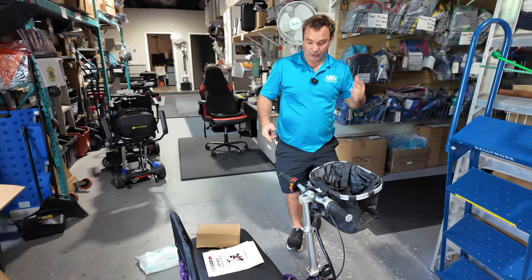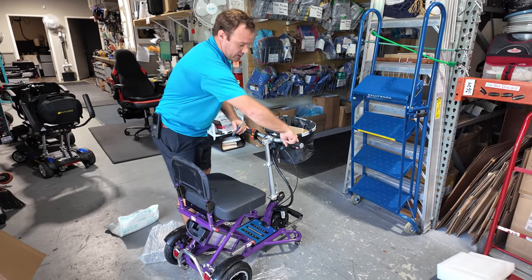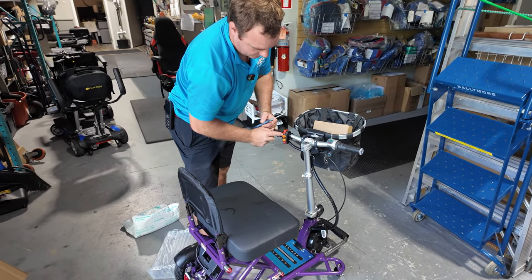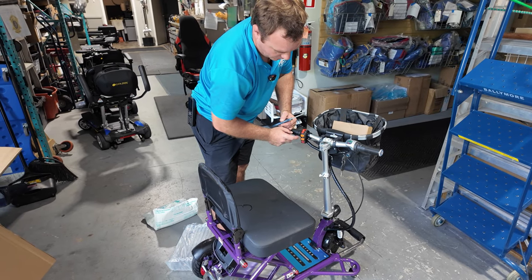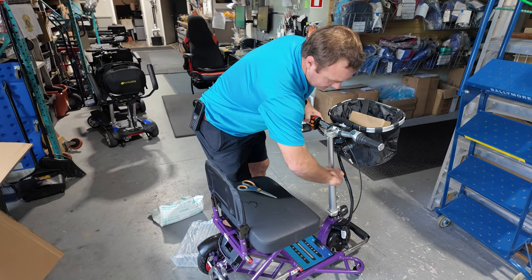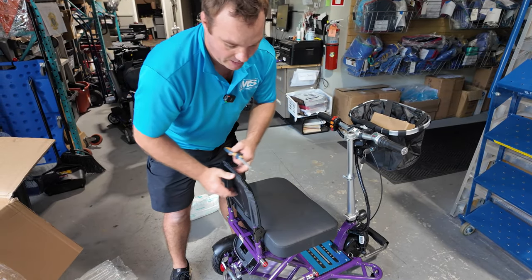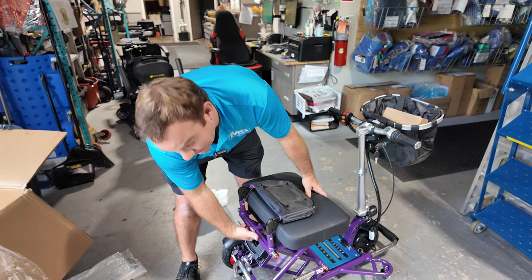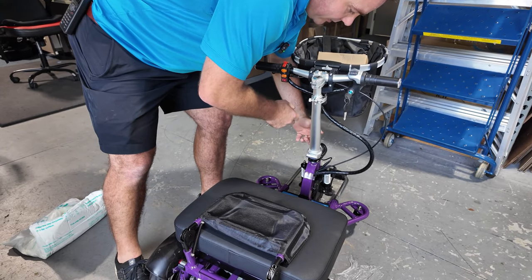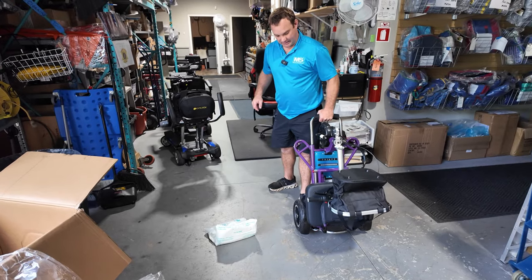That's pretty much all you have to do when you get this unit. Make sure you charge it up. The manual and charger are right here. This is how you operate it — it's like a motorcycle. There are your speeds: slow, medium, fast. Reverse, forward, horn, lights, turn off. Adjust the handlebar down or up and tighten it back up. If you're going to fold it down, this is like a ratchet — you've got to go all the way down and back up. There's a lever right here; this drops down — just watch your fingers. Tighten it back up, then there's a little clip and you can fold it down, and now you can roll it.